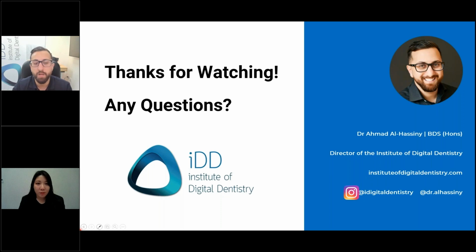But I'm not quite sure what the question is asking for, but I will say this: scanners can confidently scan anything. The only thing you need to think carefully about is full arch implants, and this is where scan gauges come in and photogrammetry. But for dentate scans, if you have teeth and gums, I've scanned pretty much anything and had great results.